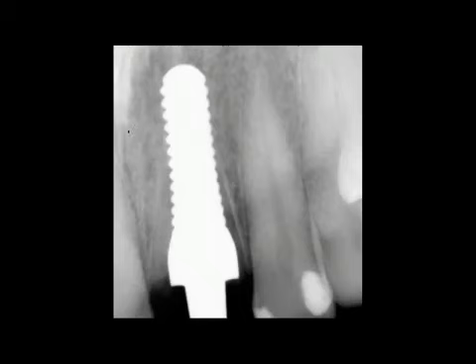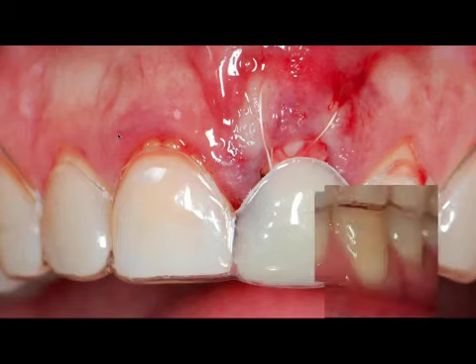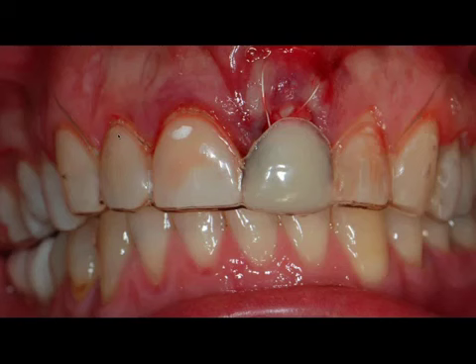That's the immediately post-operative radiograph with the implant in place. And we use a second Essex appliance as a provisional and a protective splint for the implant, so the patient can't load the implant while we're integrating. And we have an aesthetic solution that is away from the gingiva to allow the maximal gingival downgrowth. And this is what the patient goes home with.